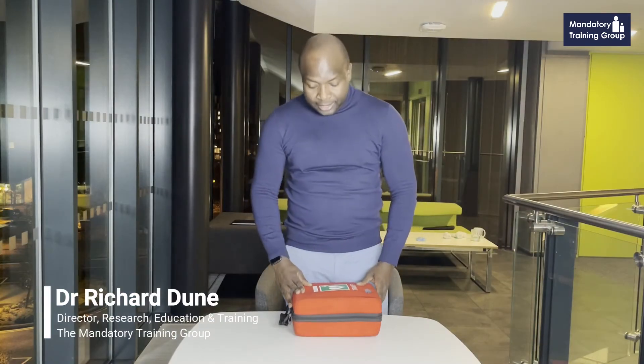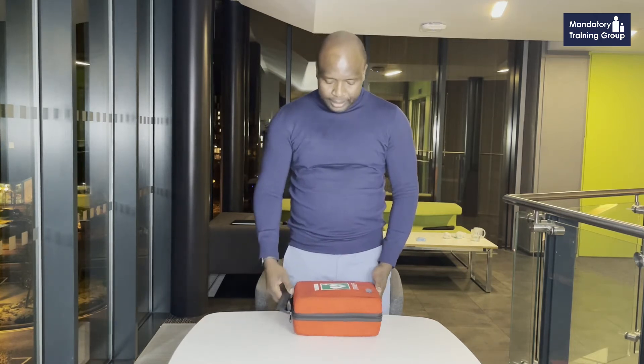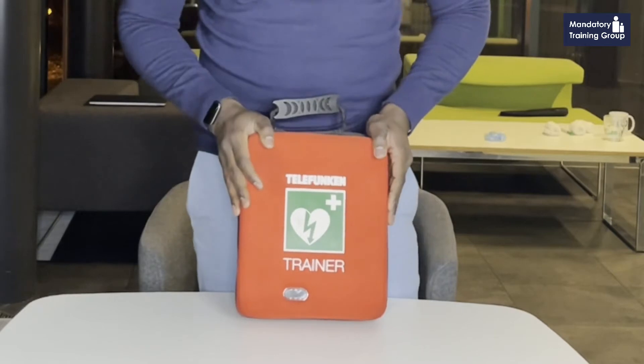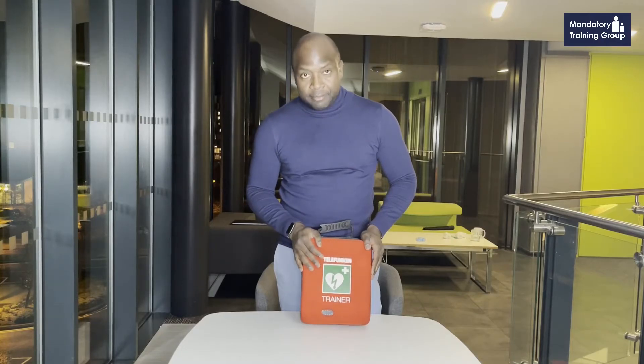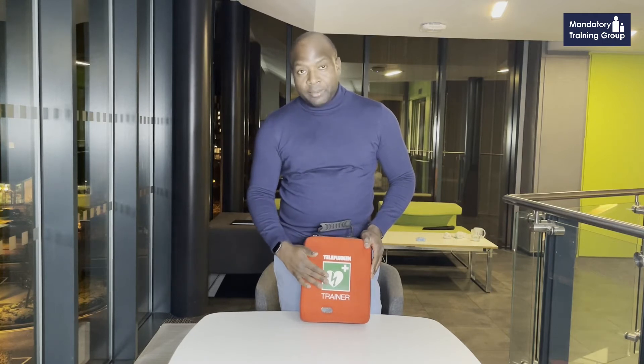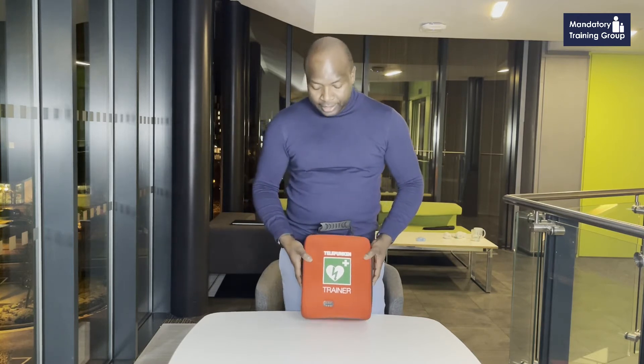I'm going to talk you through the AED, which is the automated external defibrillator. The one I've put here is a Telefunken trainer model. There are many different types of AED and many different companies making them. The unique thing about this one is that it's a trainer model, so it won't actually deliver a shock, but you can use it to mimic a real-life scenario.